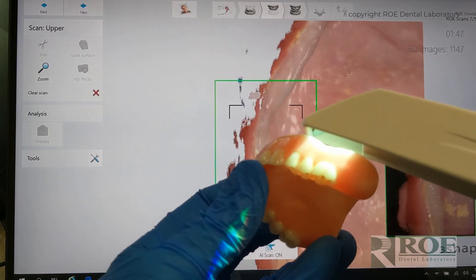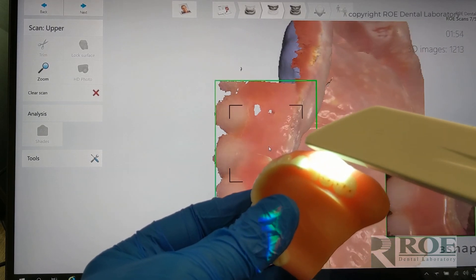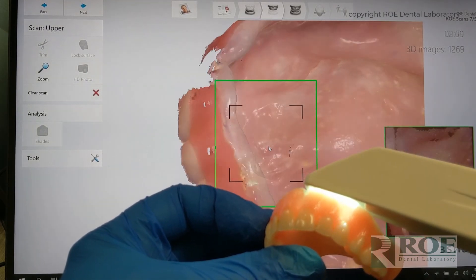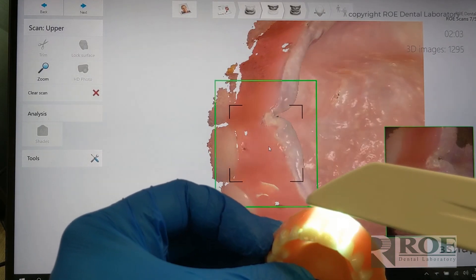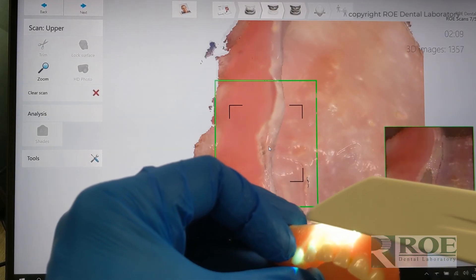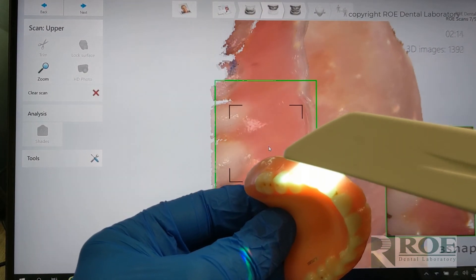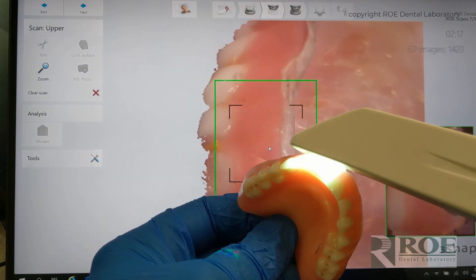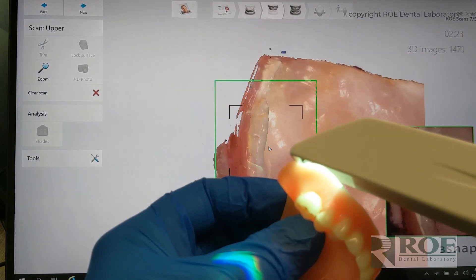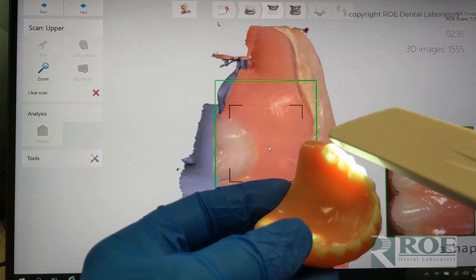Now we're going to roll over to the buccal. We're getting into some shinier areas of the denture, but this part here is usually captured pretty accurately. The trouble is always with the shiny palate. Let me move my fingers here. Pick it up, grab some teeth, come back around — a rolling back and forth pattern. Now we're going to do the full roll around to the buccal.